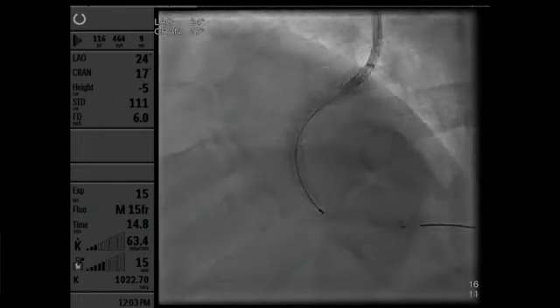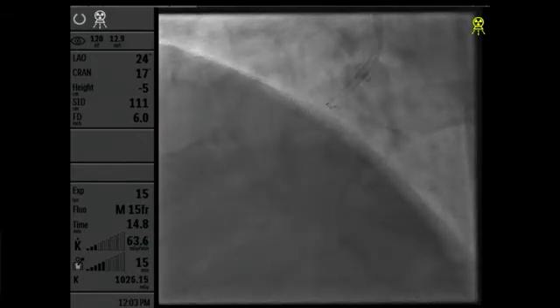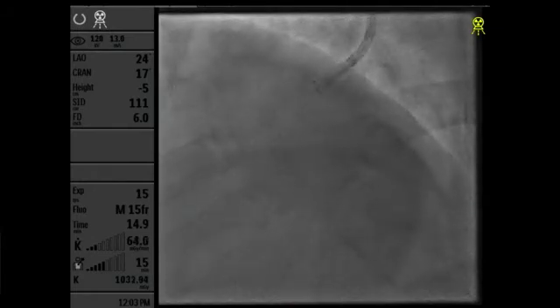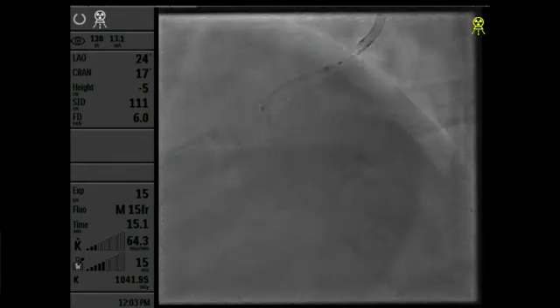We're going in now with the stent. How long are you going to stent? I have a 22. 22. And which stent is that? I'm using a Resolute Onyx. I see. Okay. On the table. So the Onyx 22. Yeah, I think we will need the GuideLiner in. Yeah, I got one.